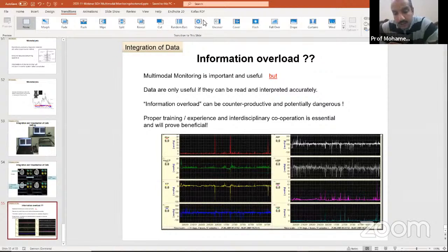The problem with transcranial Dopplers is, first, that they are dependent on the operator. Second, they cannot provide continuous monitoring. The beauty of the ICP is the continuous monitoring. At any time you have a continuous reading for the ICP, and it can simply alert you at any time and let you know that the pressure has been rising for some time.